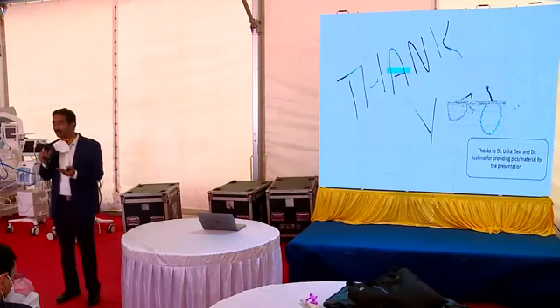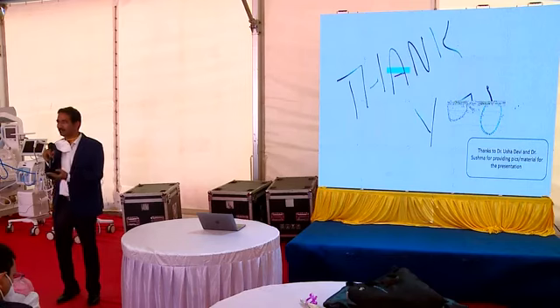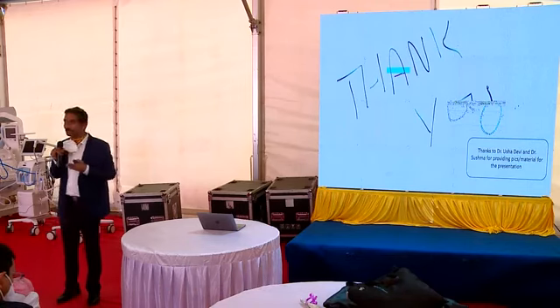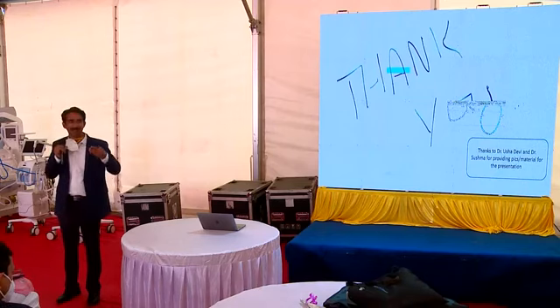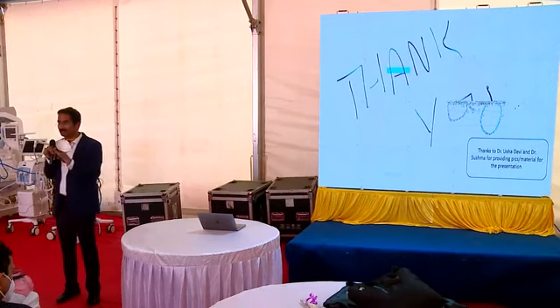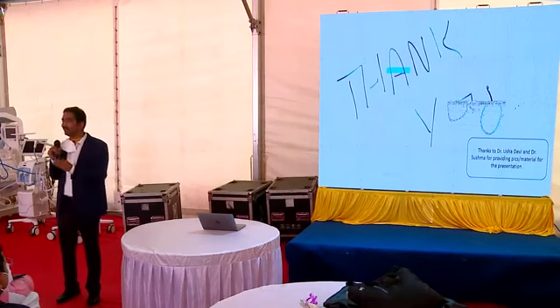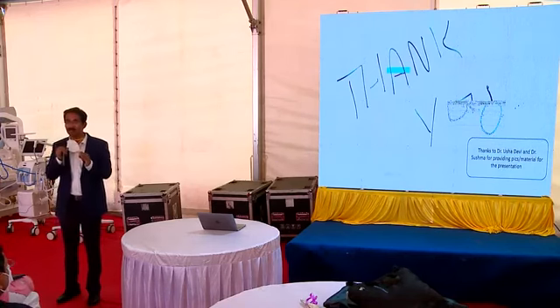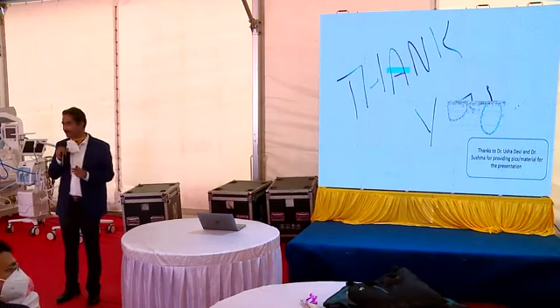The best way to learn something is when there is a malfunctioning of the ventilator, you stand and understand what is actually happening. So when the biomedical engineer visits, you should interact with them and know what is a piston, what is an oscillator, how the pressure is generated, what is a flow sensor, how does it work. Put a test lung and see how the graphics change. These are not theoretical things at all. There is a misconception that graphics, the way the ventilator works, and flow sensors are theoretical. It is not. Only when you understand these basics very well, then you can troubleshoot and you can do evidence-based care in the NICU. Thank you.